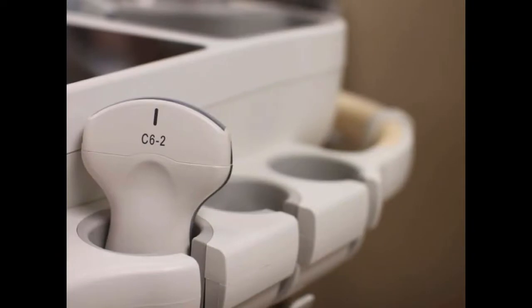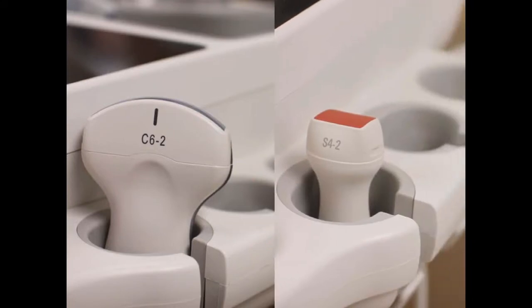Your probe of choice for this exam is going to be the curvilinear probe. It's really the best one — it's going to give you the best image. If all you have is a phased array probe it'll work as well, but if you can choose between the two, I would choose the curvilinear.